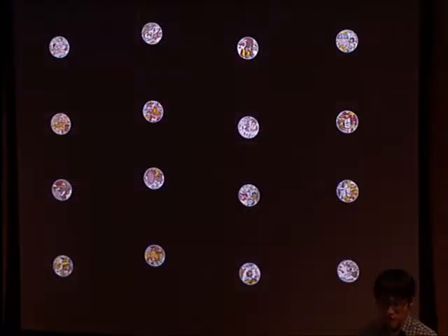But in reality, for medical imaging, oftentimes there are imaging modalities such as MRI or CT where you can image the whole organ, but your resolution is not really there to visualize the details. So that's one end of the spectrum. The other end of the spectrum is where you can take a small piece of tissue out from the patient, prepare it as a slide, and take a look at it under a microscope.